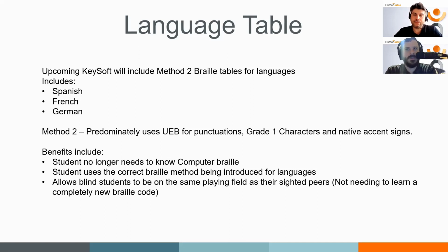And the other thing to keep in mind there is, if you are using the Duxbury Braille translator, you can utilize those same learning tables for any story, for any worksheet, for anything you want, because I'm a huge proponent of hard copy Braille. It's a great way to learn Braille. We need to learn spatial concepts and tracking and trailing and all of that. You can utilize those same learning tables that we have on the Touch Plus. Those are all available in Duxbury as well. So you can emboss hard copies of anything and apply those tables.